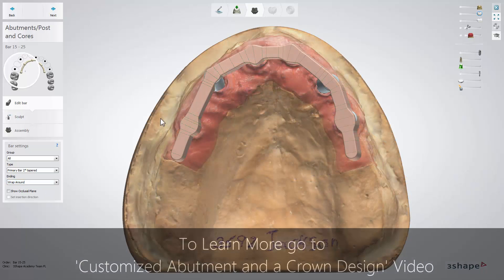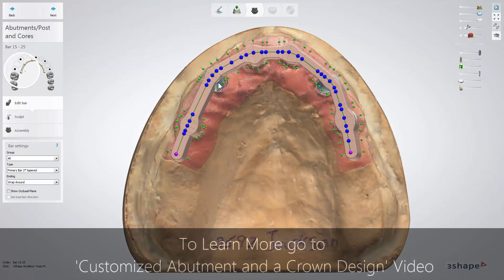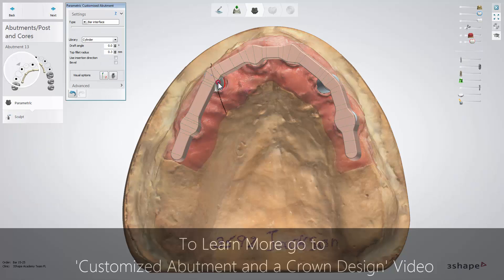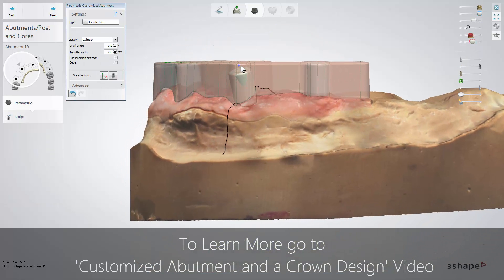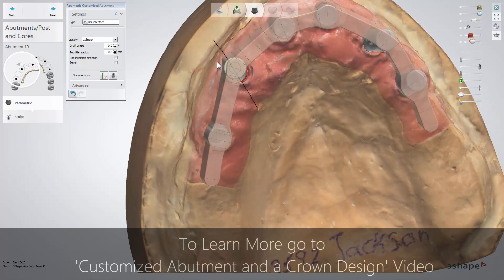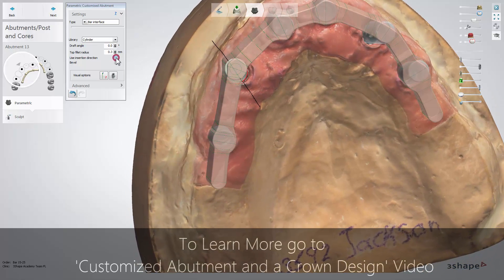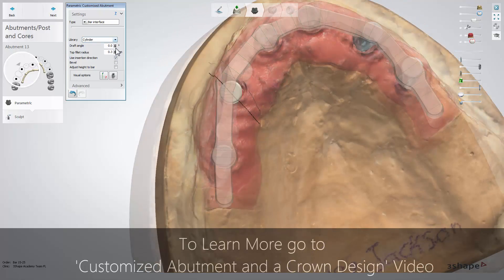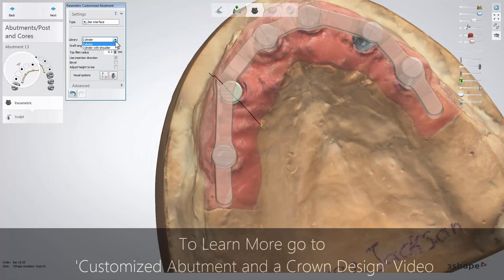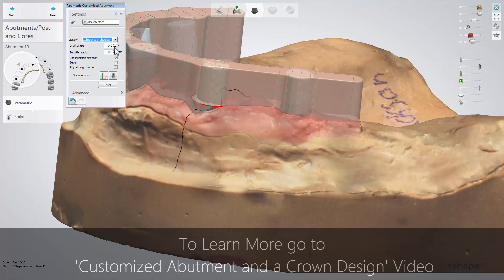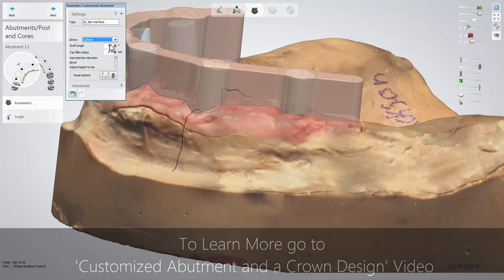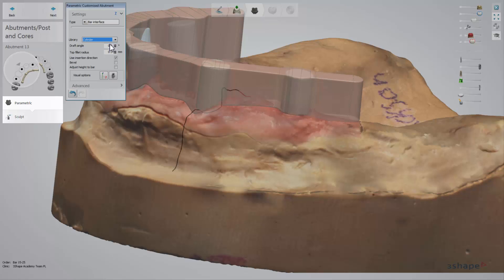When you make bar modifications, the abutment can be modified too. Just click on the abutment to start the modification. You can change the abutment's angulation in accordance with the restoration's insertion direction, as well as the abutment type. All other settings for the implant abutment are also available here, including the sculpt toolkit.